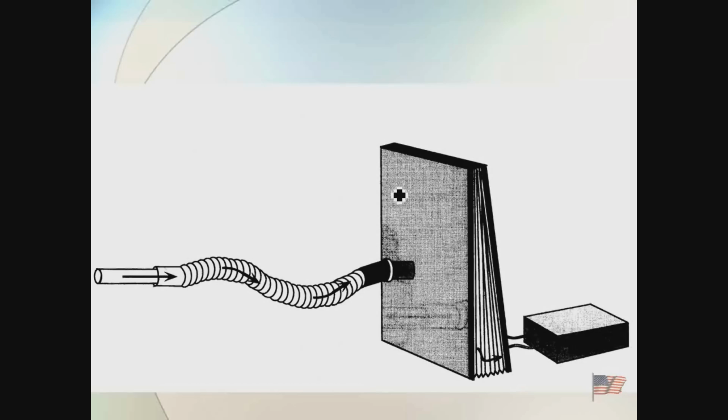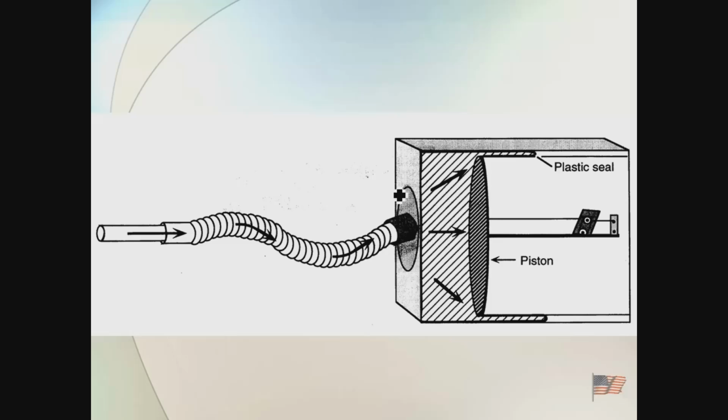And again, got to do manual calculations to determine what the vital capacity is, what the FEV1 is, etc. Here's another wedge spirometer that is there, another different type. And this is the dry rolling seal. There's actually a drum on the inside that has a small rubber silicone piece that as the patient exhales, it actually pushes that down. And there are some ventilators on the market that actually utilize this kind of a mechanism to monitor volumes.